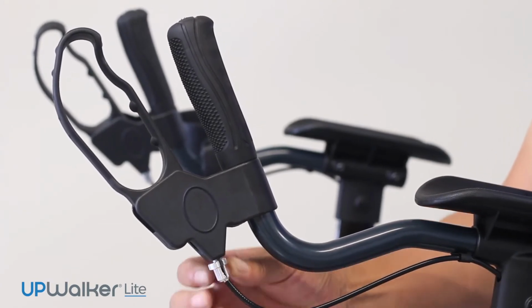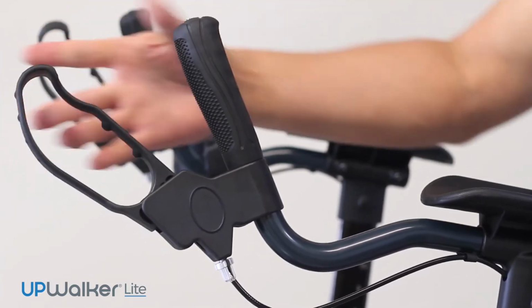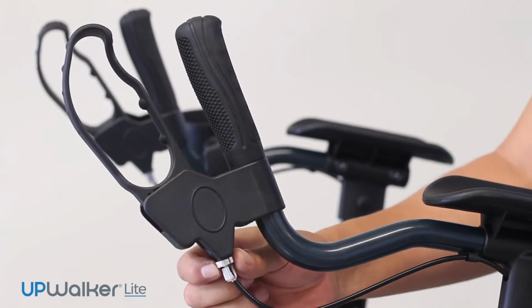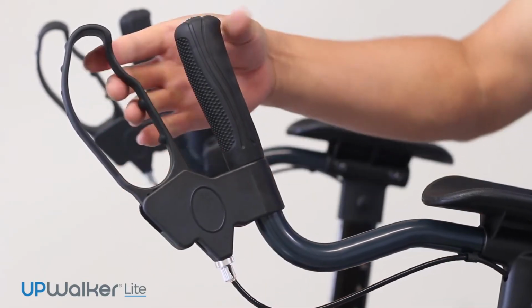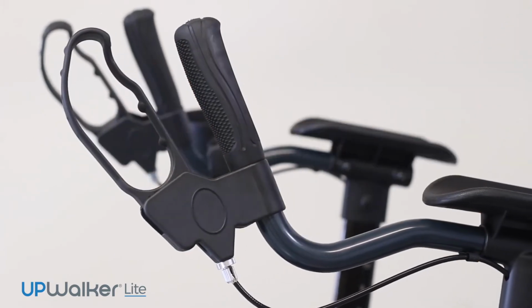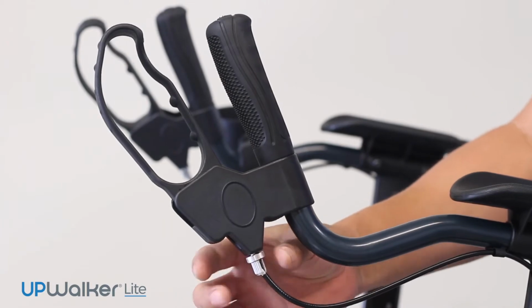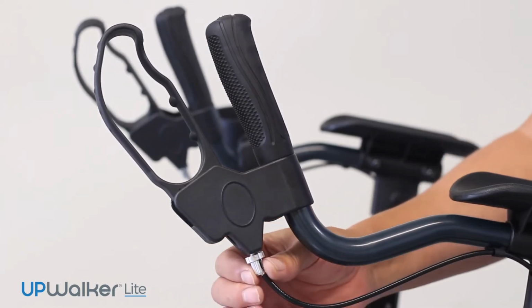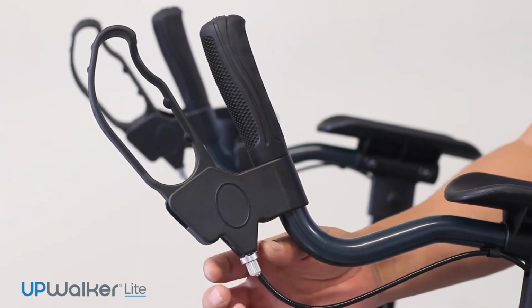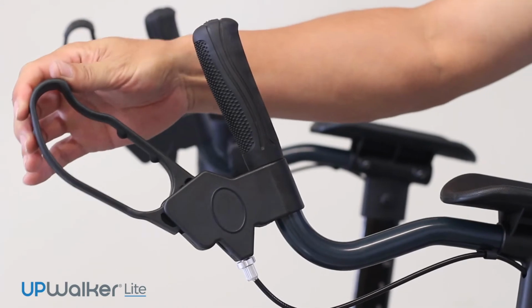If the brakes are too loose, use your fingers or pliers or a wrench to turn the barrel adjuster nut counterclockwise a half rotation at a time until the brake functions as expected. Then turn the larger locking nut clockwise using your fingers or pliers until it presses tightly against the brake housing to prevent the barrel adjuster nut from loosening up.